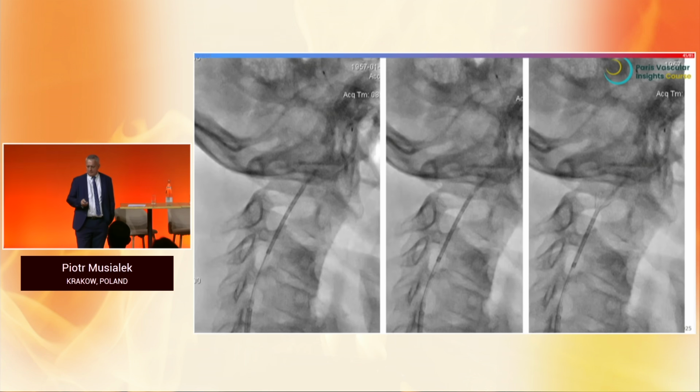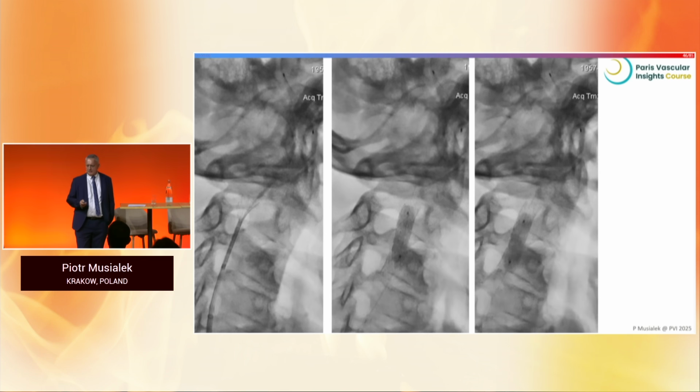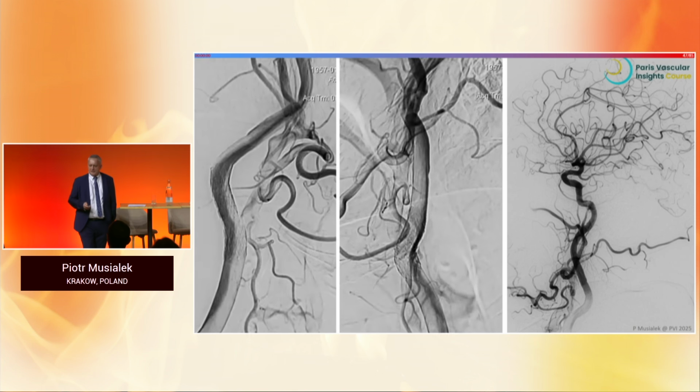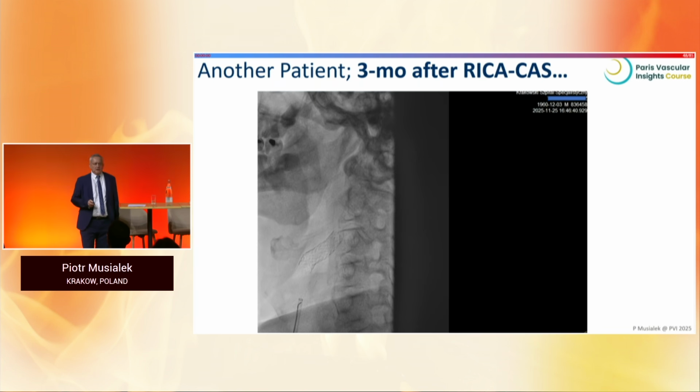And this is stent post-dilation optimization, in this case under filter protection, and the final result. Now you will ask me, Piotr, but why are you doing all this? Maybe this patient would have been fine.